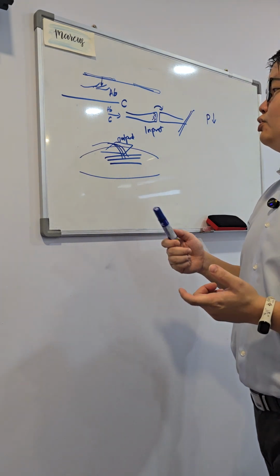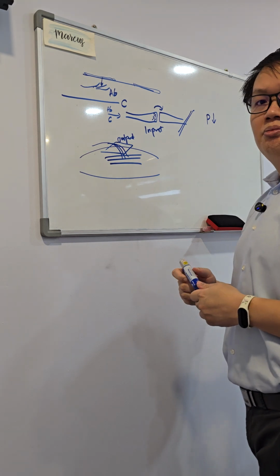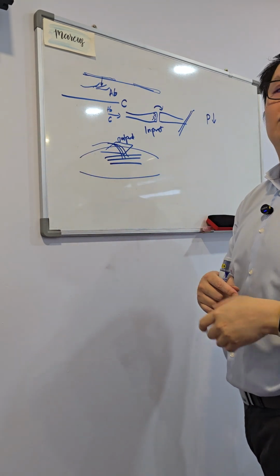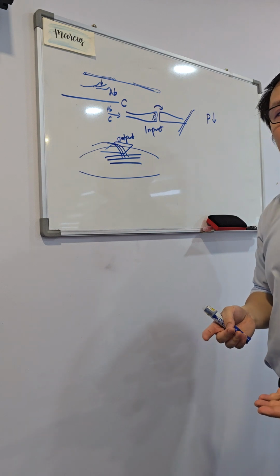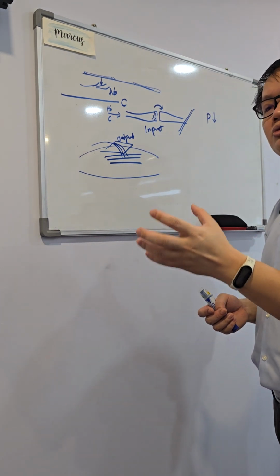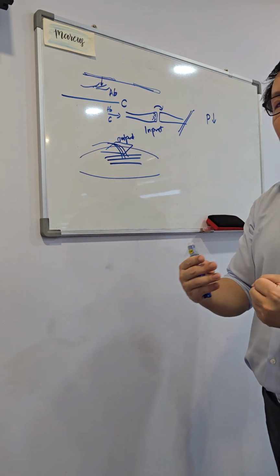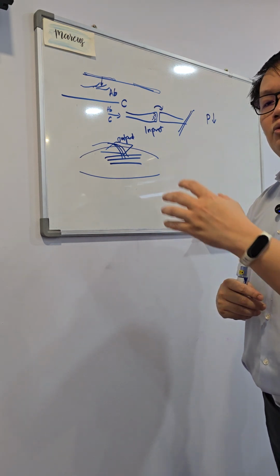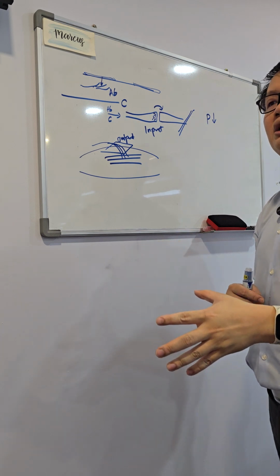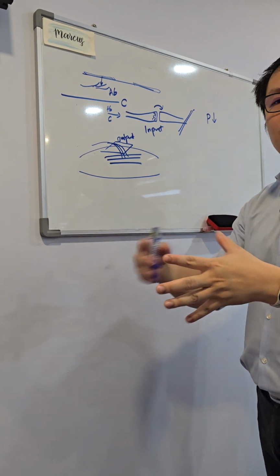Now, why are we doing this? Maybe because the brain decides that we need to go into a guarding response. Therefore we are modulating it by stimulating the muscles to contract in a rhythmic manner. We contract it, let go, contract it, let go. Okay, we don't randomly shoot signals.